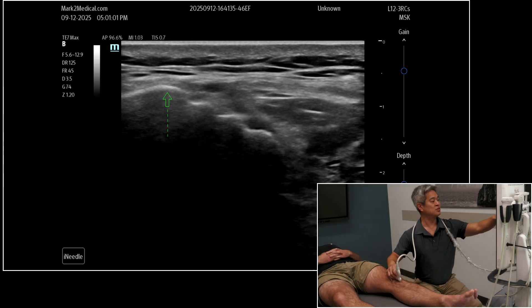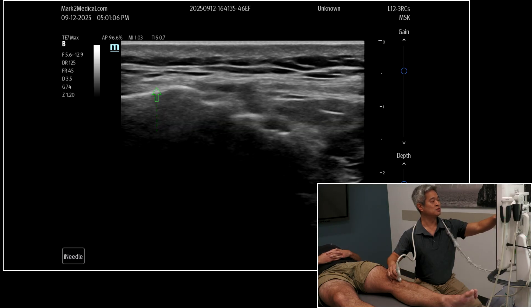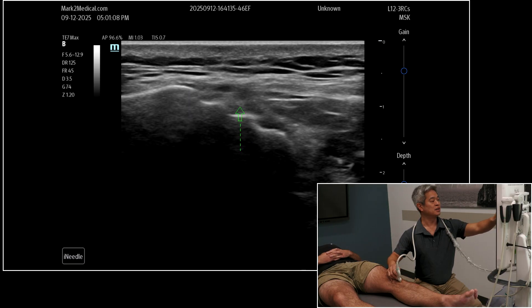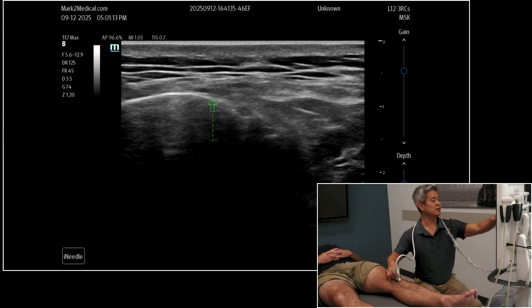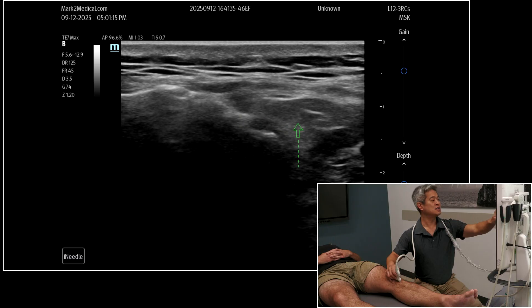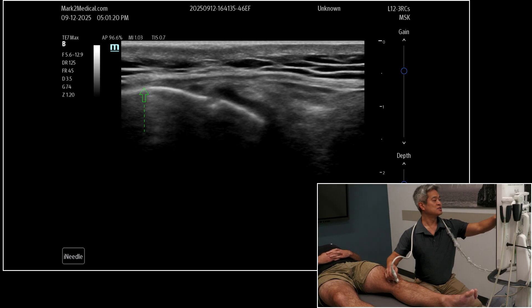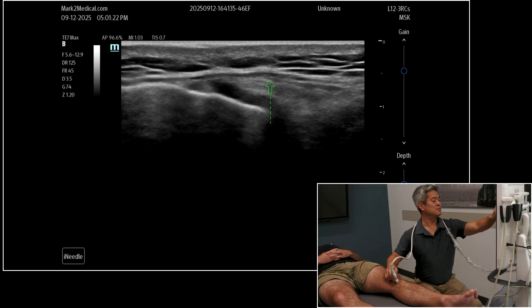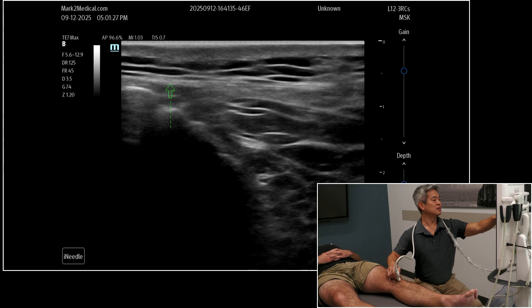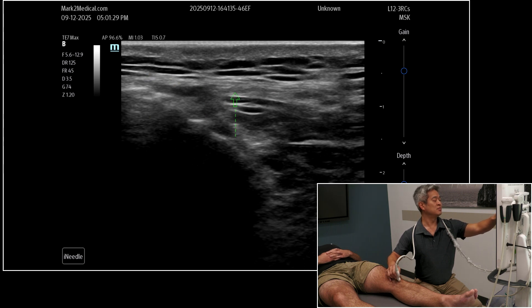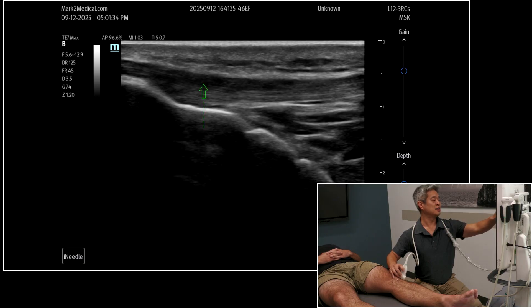The medial patellar retinaculum attaches on the medial aspect of the anterior tibia next to the tibial tuberosity. Again, you can have cortical irregularity and hypoechoic signaling here in people that may be symptomatic. Continuing to roll medially, you get the medial meniscus and MCL. Then moving laterally again: medial patellar retinaculum, then moving more laterally still, back onto the patellar tendon.